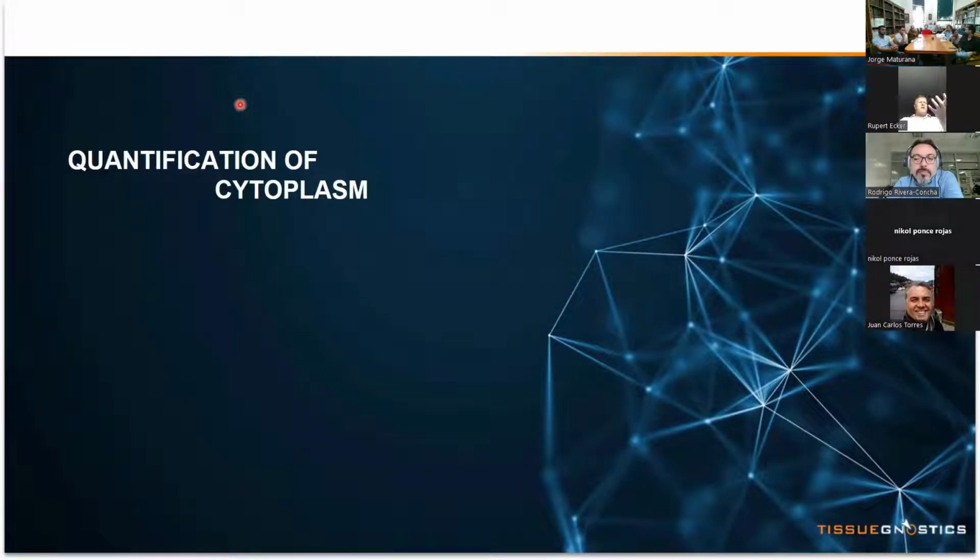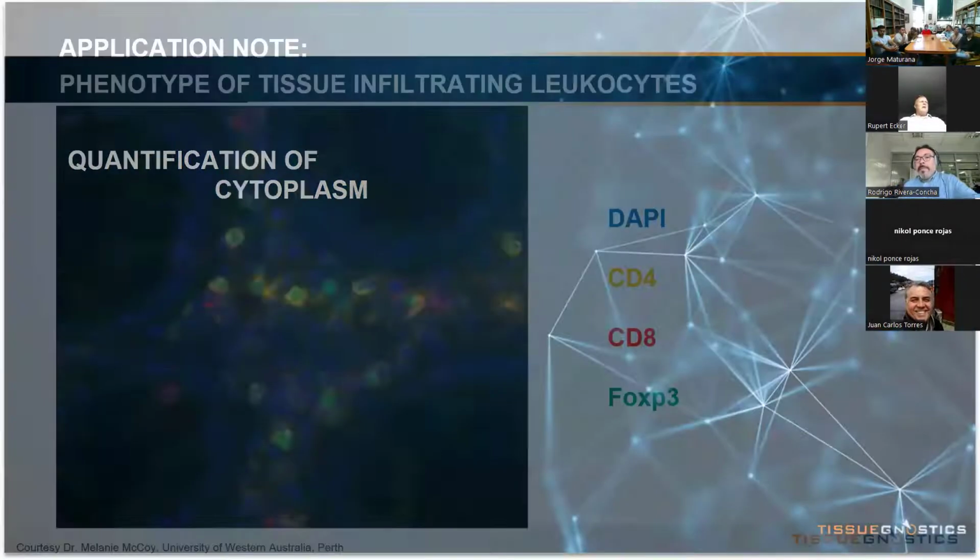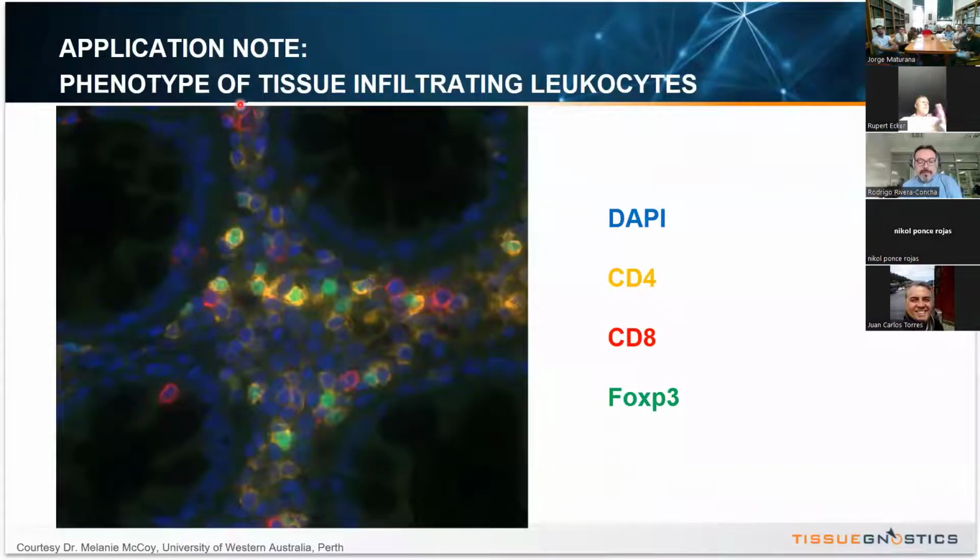Ki67 is a marker that is expressed in the nucleus. And so we just identify the nucleus and use the same measure mask to measure also the brown staining. In case we have a cytoplasmic marker, we use a secondary measure mask. It's also the nucleus, the primary mask, but we generate a secondary measure mask around each nucleus that captures the cytoplasm or the membrane stain.